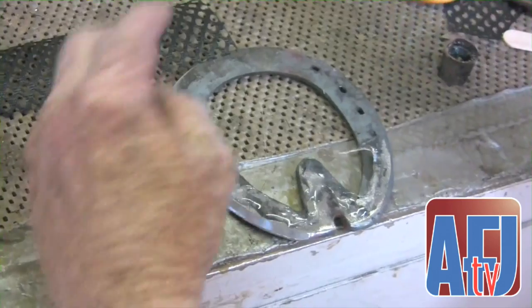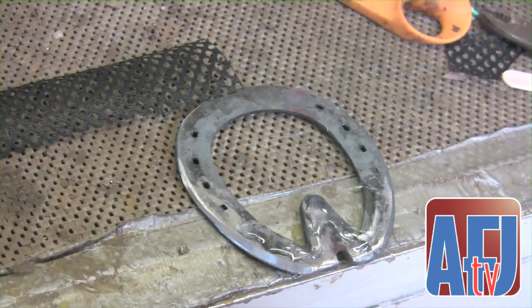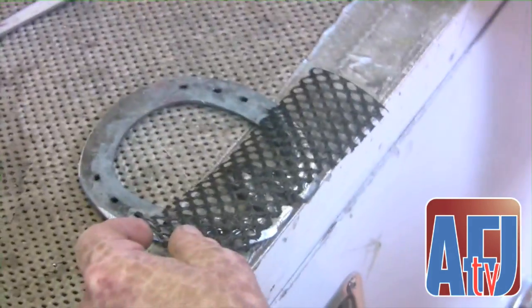That area was not able to carry weight adequately, so we ended up putting a heart bar shoe on her and filling that back area with a Vet Tech silicone, so we could distribute the weight clear across the back of that foot. Each time she accepted weight, she didn't have to take it just on her side wall, which was not adequate to support that weight.